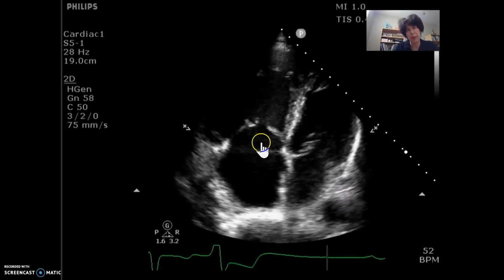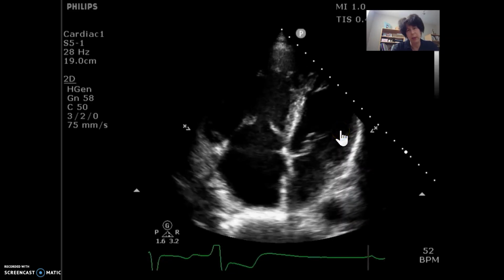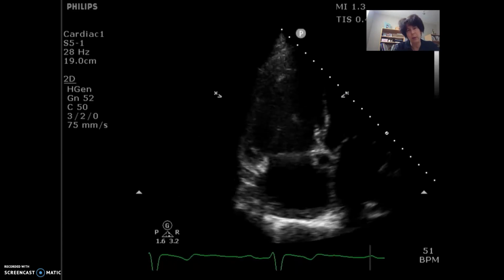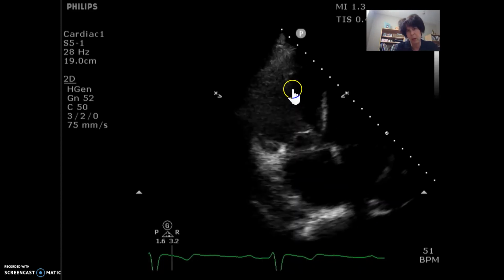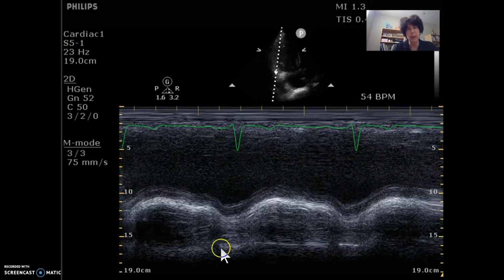You can see your mitral valve here opening well. I would say that this LV, from what we can see, we're not seeing endocardium 100% clearly, but what I can see, I don't think that LV is contracting normally. This is a more RV-centered view, and a really good look at this base as well as the free wall. And doing a TAPSE through there, it's not measured, but I'm almost 100% sure that if you do the measurement, it's going to be less than 16 millimeters, so decreased RV function.